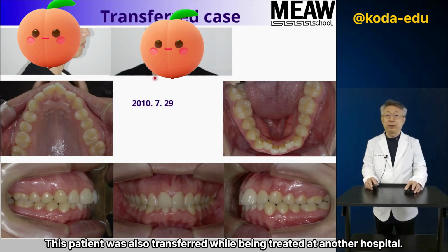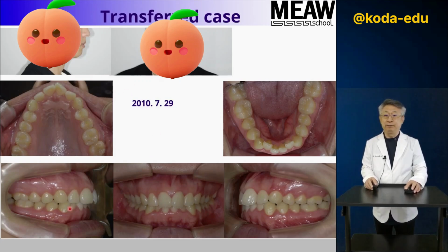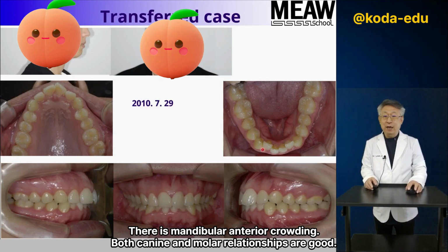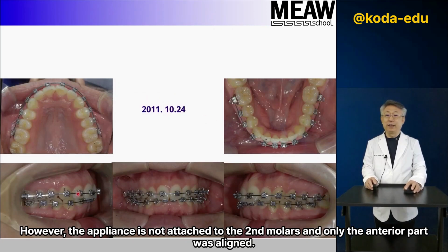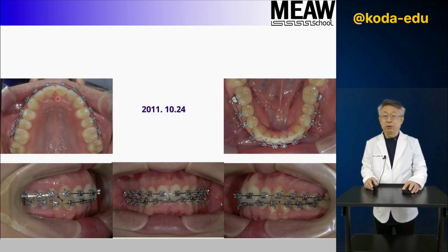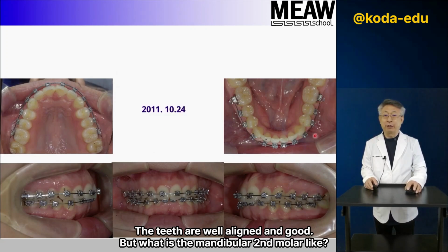This patient was also transferred while being treated at another hospital. There is mandibular anterior crowding, both canine and molar relationships are good. The profile isn't bad either. However, the appliance is not attached to the second molars and only the anterior part was aligned. The teeth are well aligned and good.